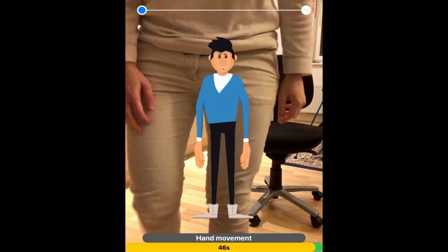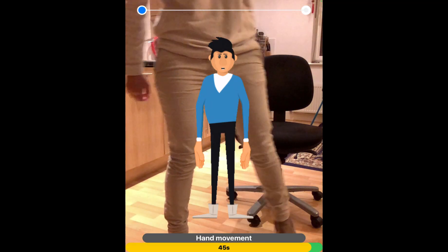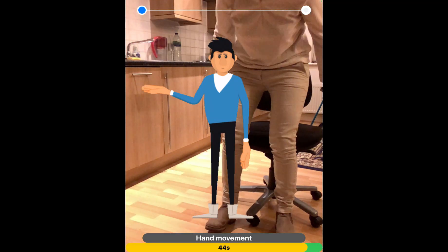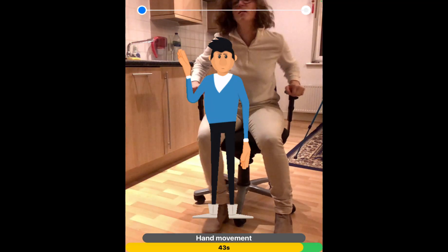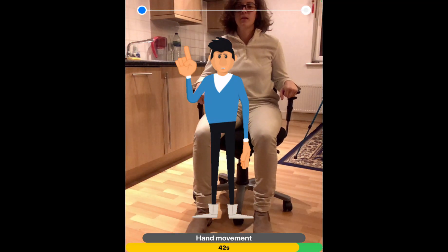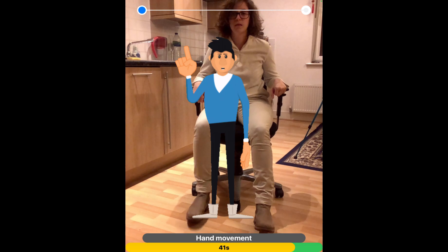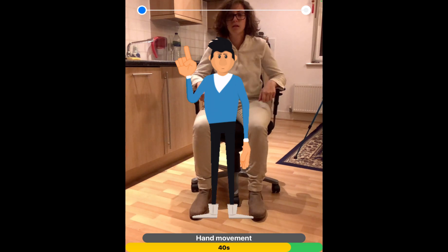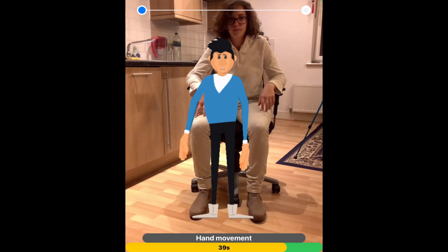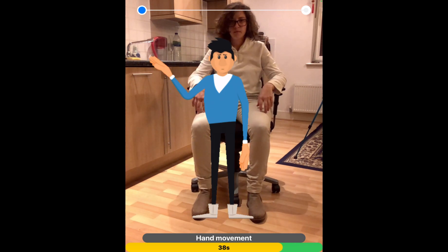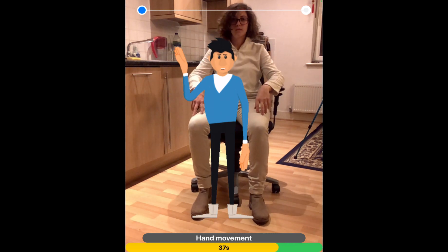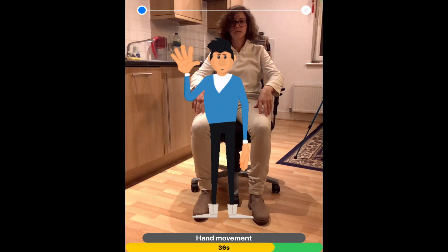We will soon start assessing your hand movements. First, I will demonstrate the action. Open and close your hand as fully and as quickly as possible, 10 times.